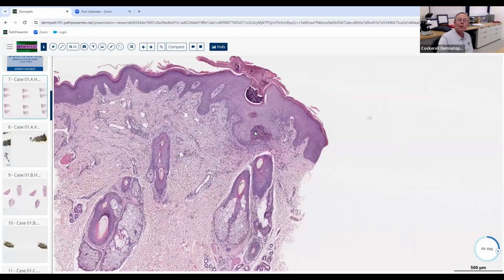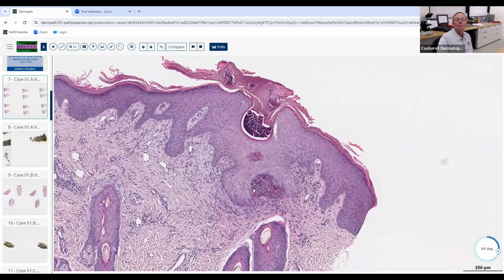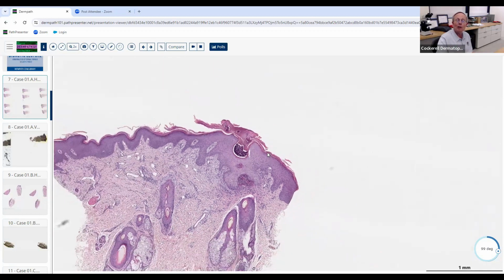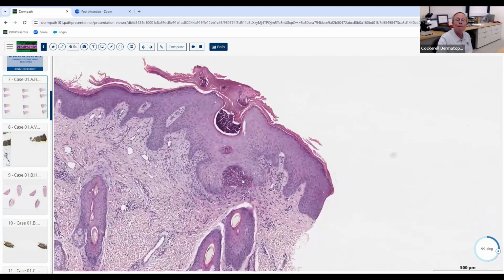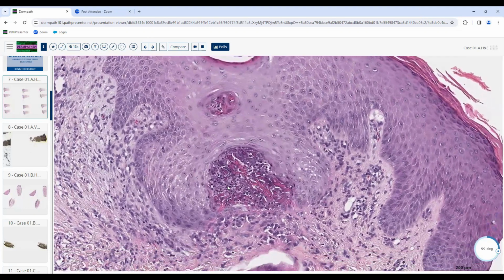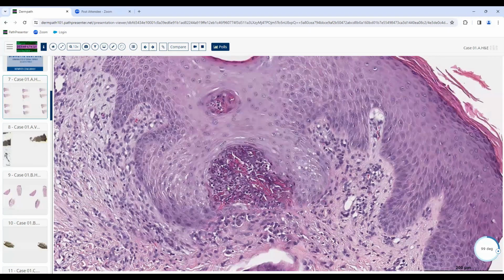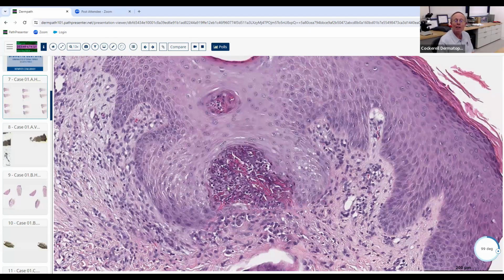So we've got a pathology that's situated here in this hair follicle, right? This is abnormal. It's acanthotic. It's got hyperkeratosis, hypergranulosis. So what can you say about it by definition if it's got hyperkeratosis, hypergranulosis, and it's on a hair-bearing skin? What do you know that means the patient is doing to themselves? Oh, they're rubbing themselves. They're like scratching and rubbing. Scratching and rubbing. It's lichen simplex chronicus.